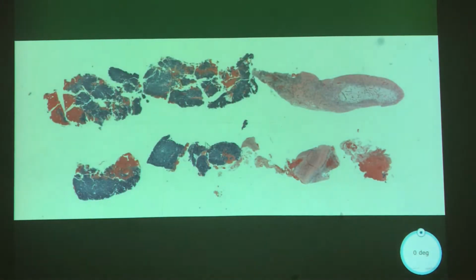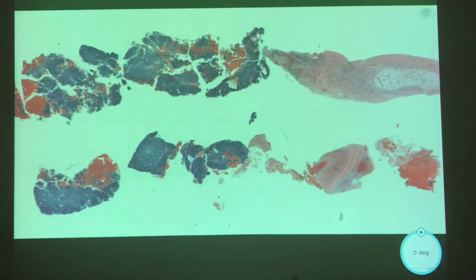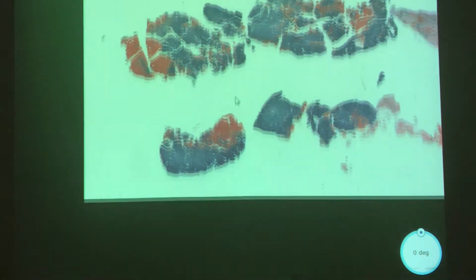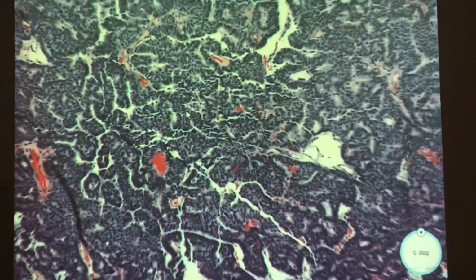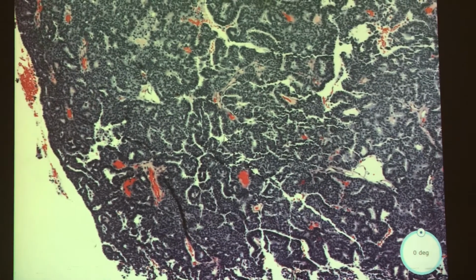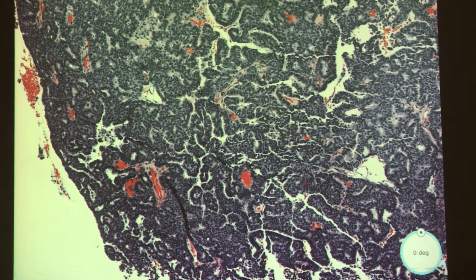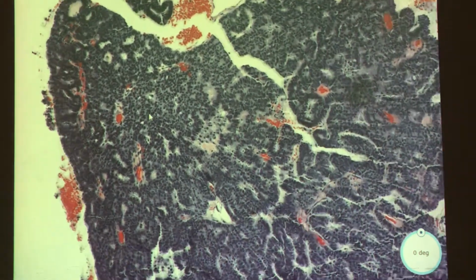So now we go back to the slide, and this is the next case. Okay. Very blue. Very blue. I'm assuming breast tissue. So let's just look at some. Oh, okay. So I would say it's kind of like a micropapillary configuration. Maybe some cribriforming of these cells.